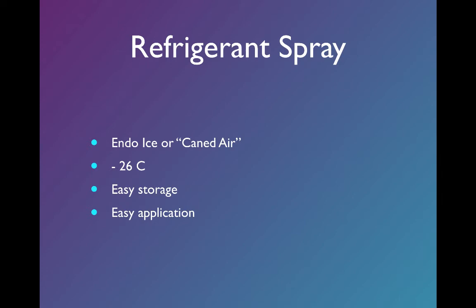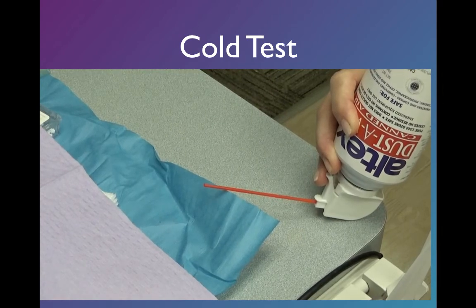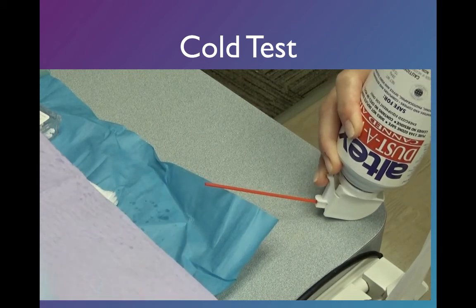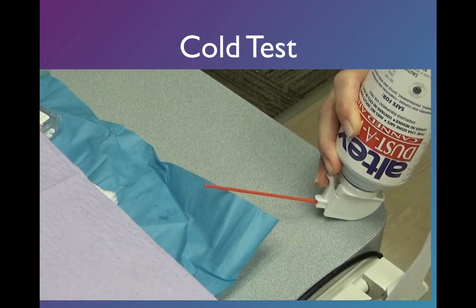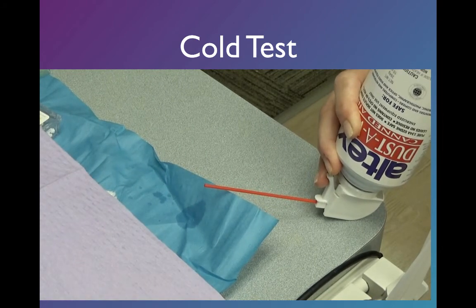It's minus 26 degrees centigrade. It's easily stored and it's easy in application. And this is how we use the canned air spray. It has to be held upside down and the assistant can hold it. And then we place the cotton in front of the pipe coming out of it. And now that cotton is minus 26 degrees centigrade. And we go directly to the mouth and test the teeth.